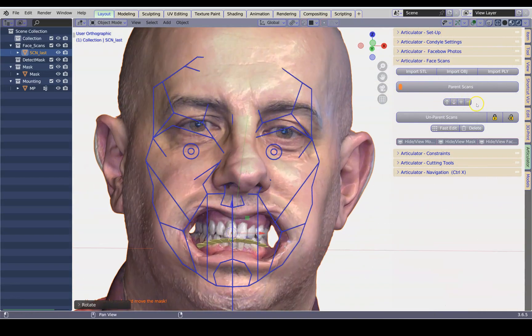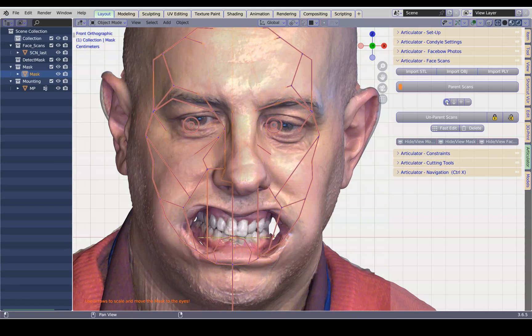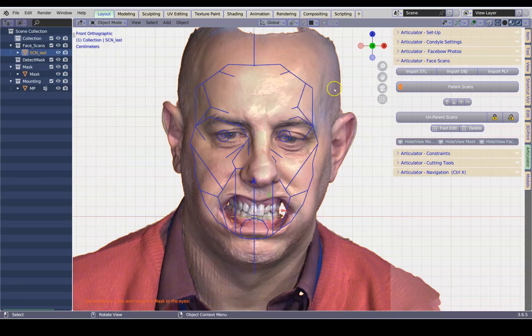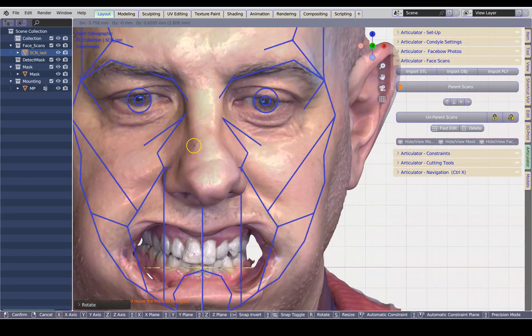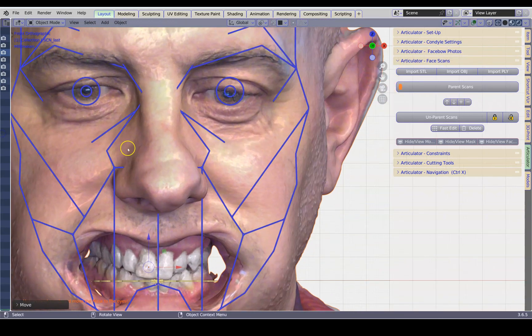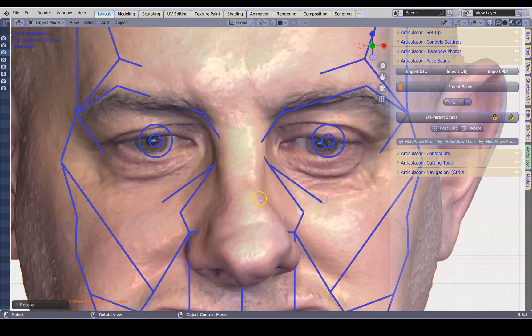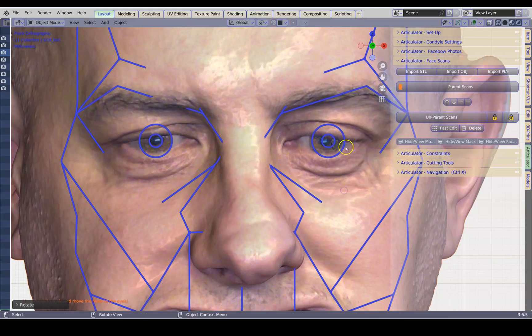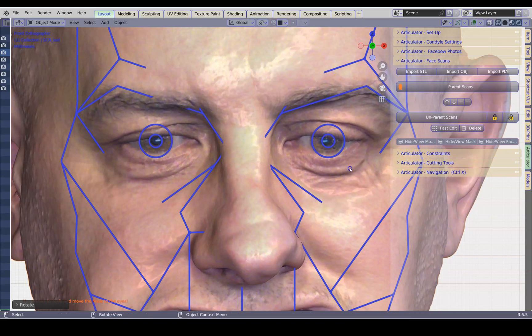These controls over here are for the mask — the mask is going to move up and down on these arrows. We're not going to rotate the mask at all; we're going to move it up or down and scale it according to the pupils. So I'm going to select the scan and using the R key and the G key, move it within these pupils over here. The pupils are a good indication unless the orbital sockets have been moved by an accident or birth, but it gives us a good indication. And if we can get this correct, then we can say that we've got a good midline as well.